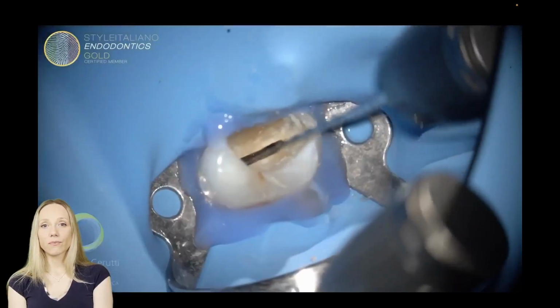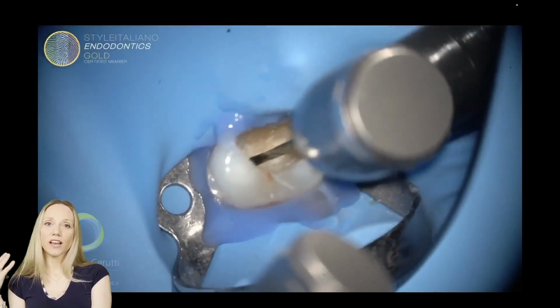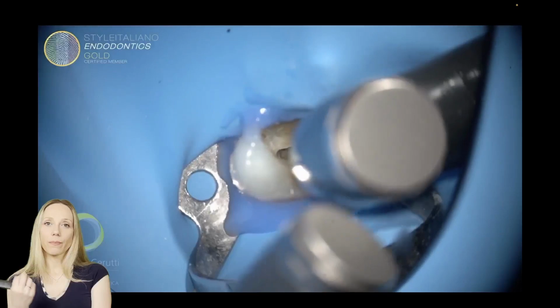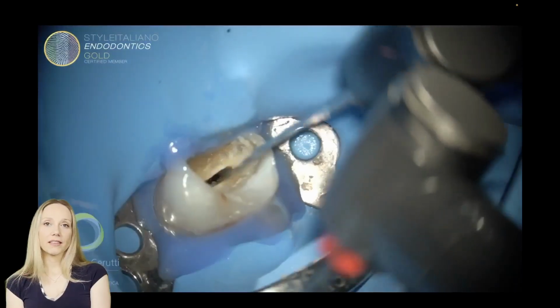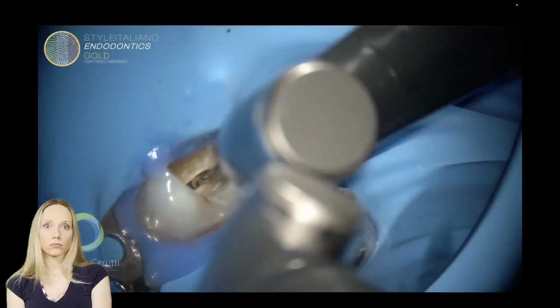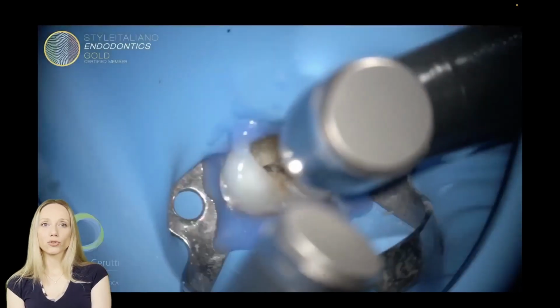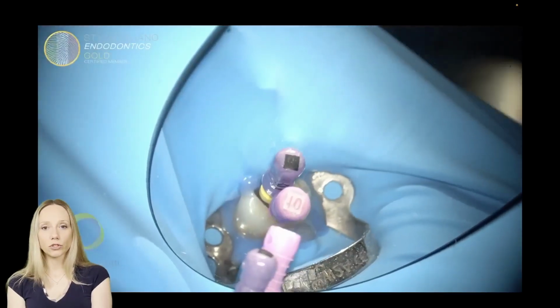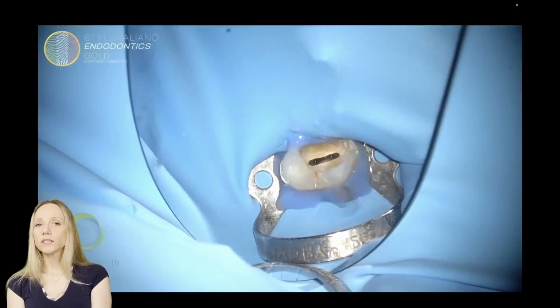Second, if my instrument has a straight line axis, it will follow better the original path of the root canal, and I will avoid stressing my instrument and perhaps enlarging too much the middle third of the root canal, or straightening some curvature, etc. So what did I do?